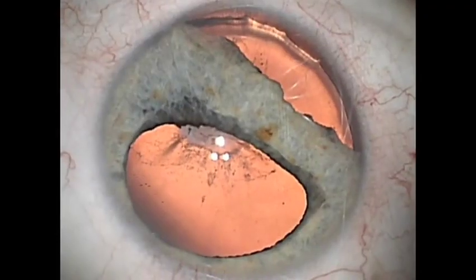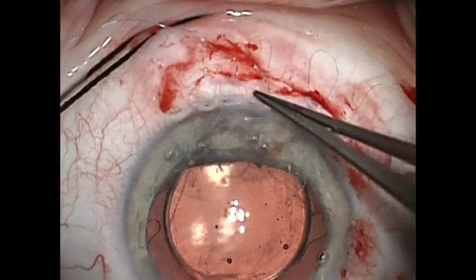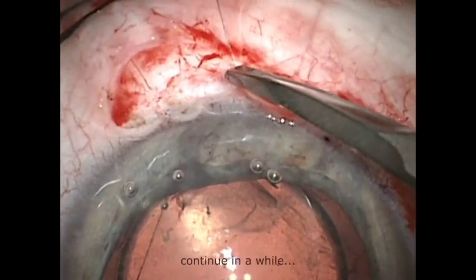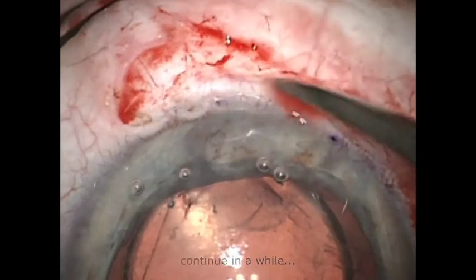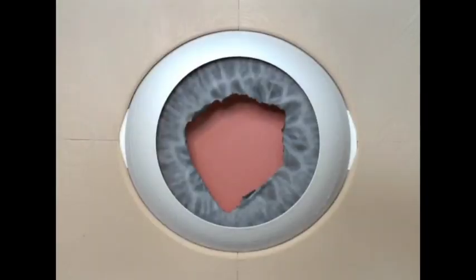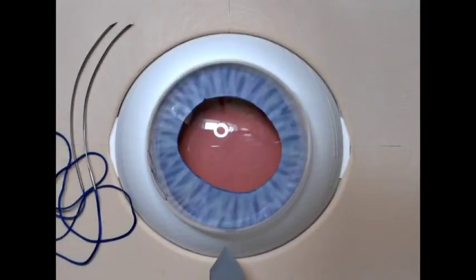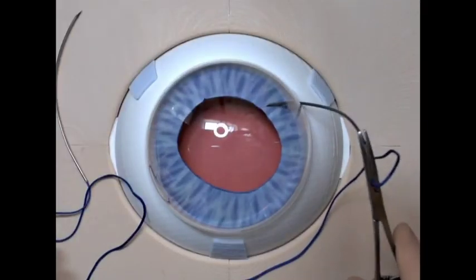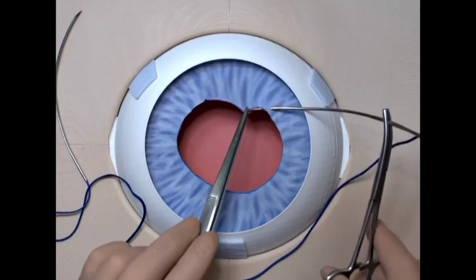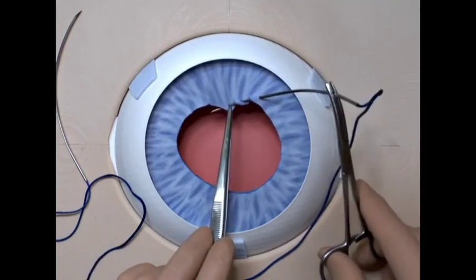We need to be careful not to retract the externalized loops back into the eye during the procedure. A wide pupil can be narrowed with simple interrupted sutures, which is suitable in partial defects or in irregularities in the tone of the iris. If the iris tissue appears homogeneous, we can use a circular suture, also known as pupil cerclage.